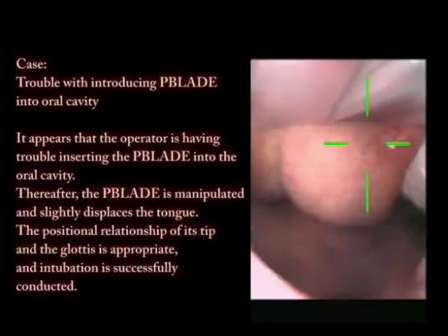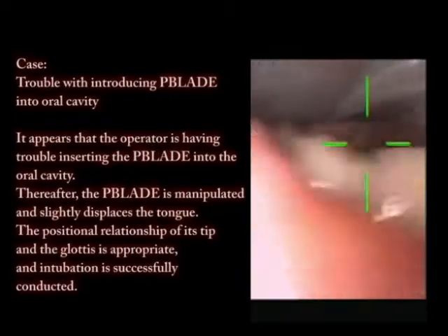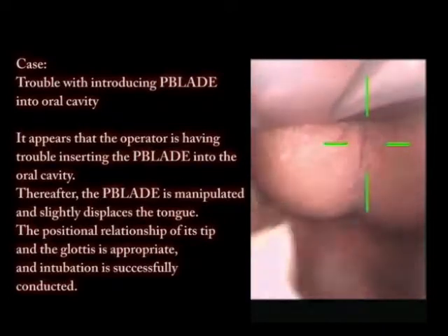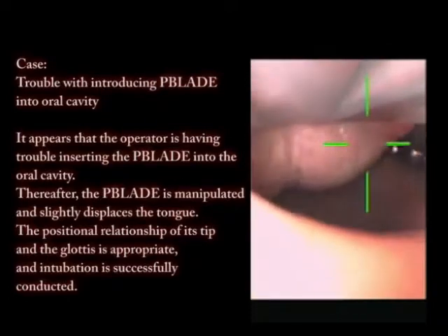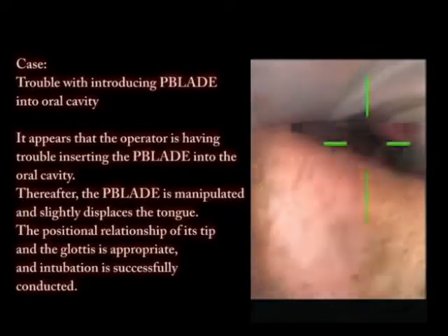Trouble with introducing P-blade into oral cavity. The operator is having trouble inserting the P-blade into the oral cavity.